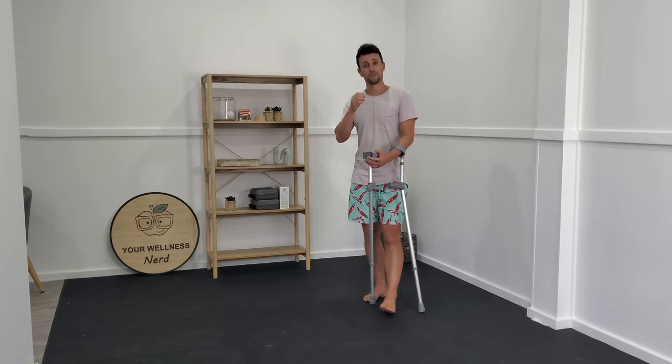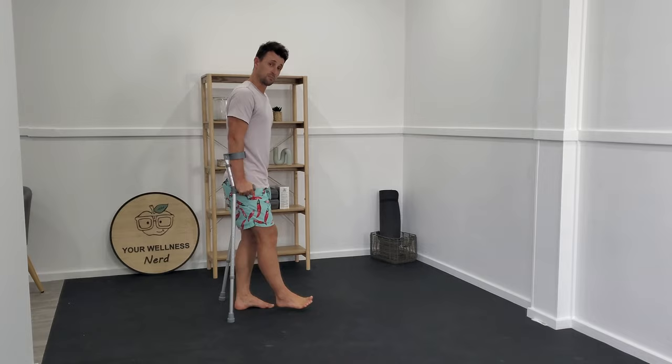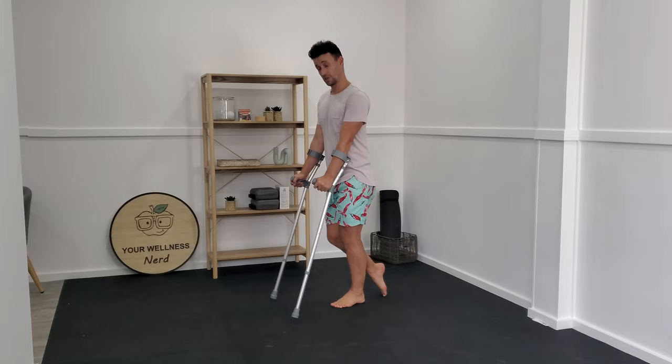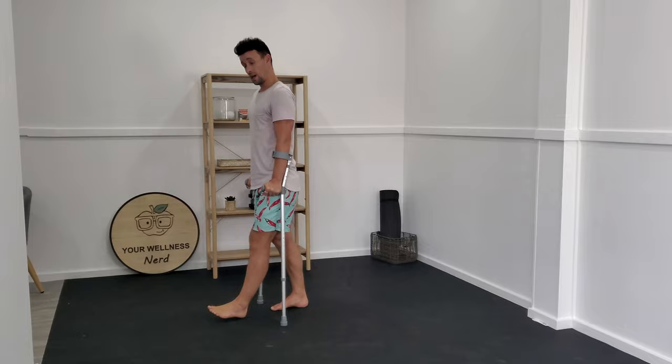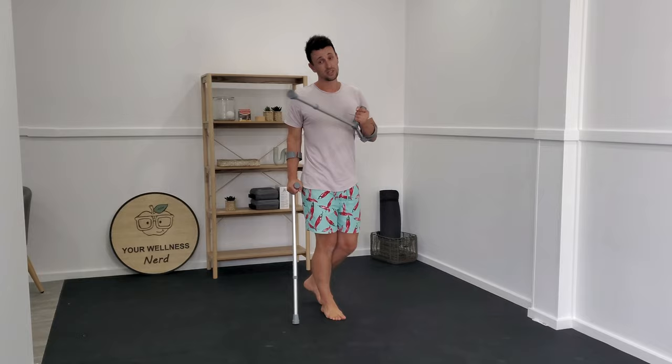If you can keep reminding yourself that the reason why we have these crutches is to just absorb what you don't currently feel comfortable with, then the next most important question is: when do you get off your crutches? If you feel like you're walking as normally as you can with the crutches and you can progress to a point where you don't feel like you need them and you can carry them, then you can be safe in the knowledge that you're at the point where you can genuinely consider getting rid of these crutches.